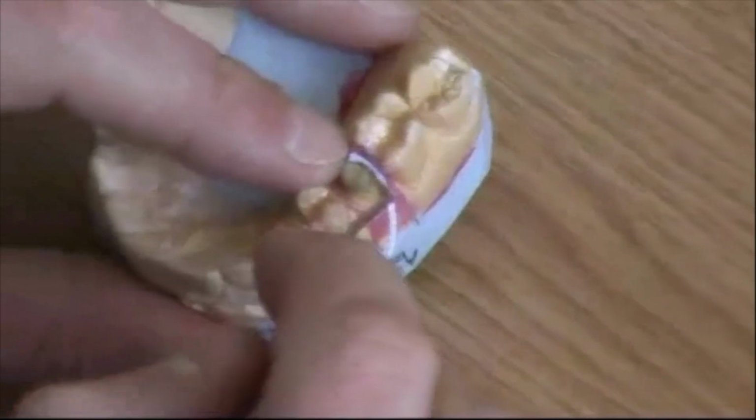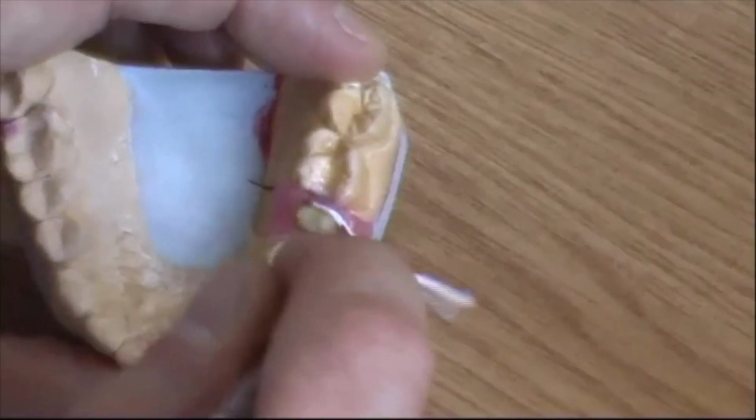And you say, why do we want this? Because what we want to have there is only the fluid material, the very, very precise impression material, not the base of the impression, which is the putty. And so that's why some people put 2 cords. But about impressions, that's another discussion, which is the best type of impression.